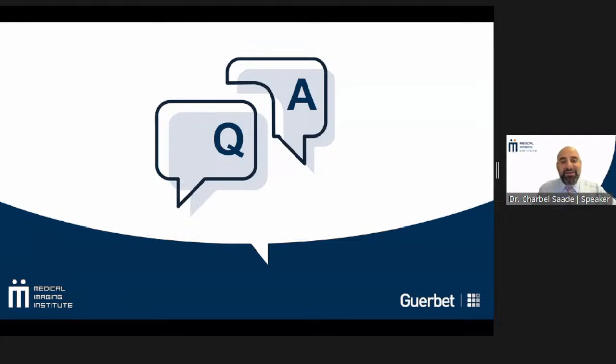This is an interesting question, and every webinar we do get this. How do you flush with saline when using a single syringe power injector? My dear friend, you can do it potentially, but we don't recommend this practice at all. You need an injector with two syringes because if you put contrast and saline and you tip it down, we know that contrast is heavier than water. But also there's potential mixing that could happen there. And when you're injecting, depending on the pressure and flow rate, and you're predicting a volume, you're not going to be able to reduce contrast volume as well. So you have to say, okay, I've got to give 100 mils of contrast, then 100 mils of saline, and then inject. Whatever happens, you're injecting 100 mils of contrast. So this is where the limitations begin. Ideally, you'd want to use a dual pump system.